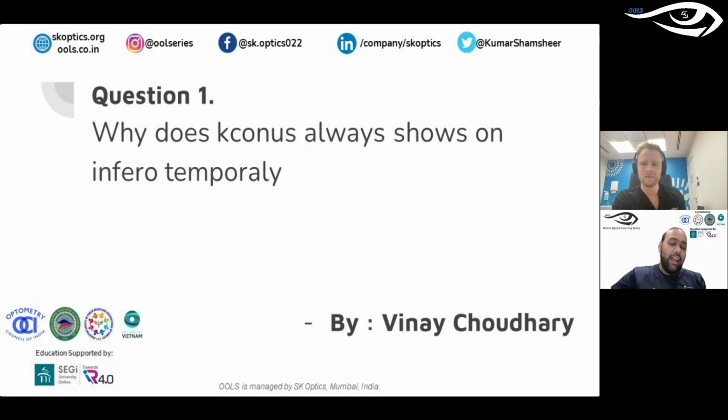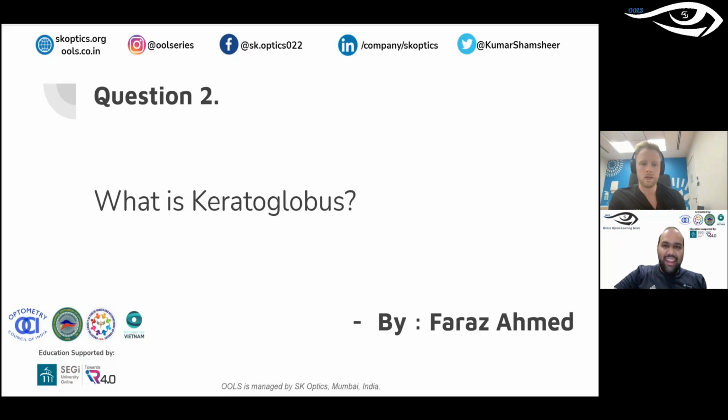That's right. As you said, if we know the majority of them have that inferior temporal inclination, it would be very helpful for us as a starting point. At least we know where to play around, rather than going through 360 degrees. And look, if you do have a Pentacam, look at that as well. Just see where the cone is, where you're aiming for. Don't go in blind.